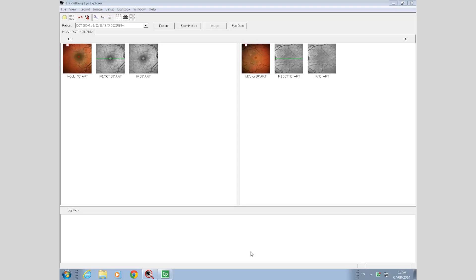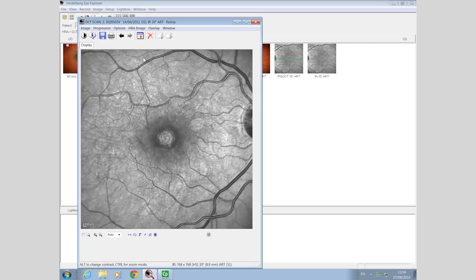We'll first select the infrared reflectance image from the image icons. The most noticeable appearance is an area of absorption of the infrared light at the center of the image in a ring form. There is a bright, highly reflective central circular lesion visible.